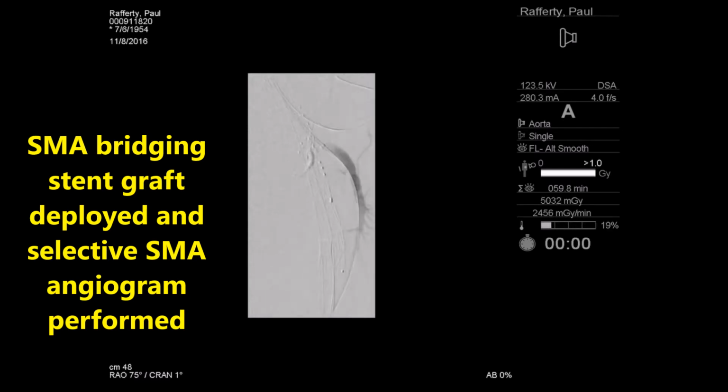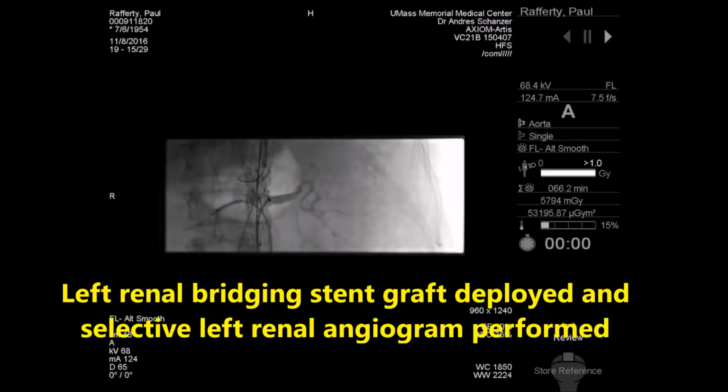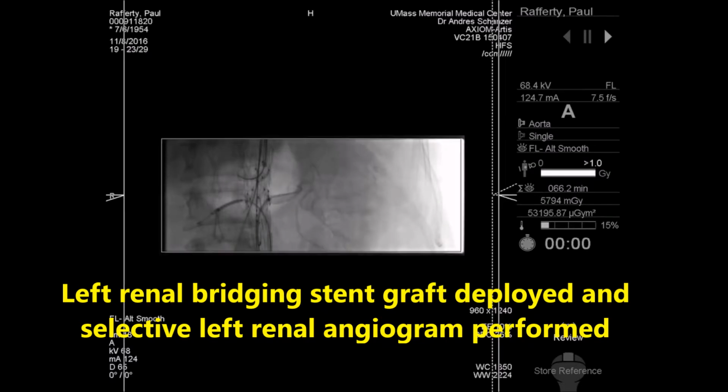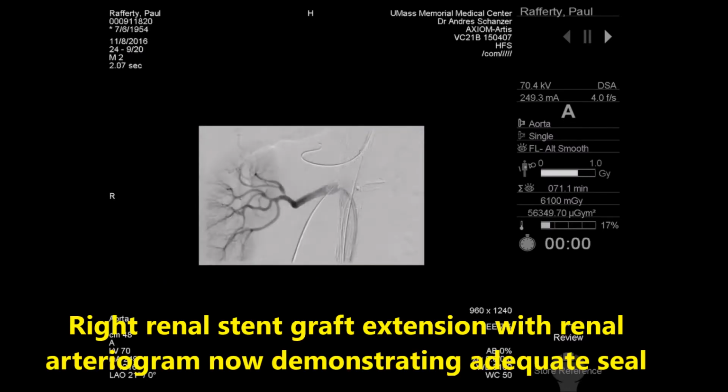An SMA bridging stent graft is deployed, and a selective SMA angiogram is performed. A celiac bridging stent graft is deployed, and a selective celiac angiogram is done. The left renal bridging stent graft is deployed, and a selective left renal angiogram is performed. The right renal stent graft is deployed, and the angiogram demonstrates an endoleak due to inadequate length of the bridging stent graft. After the right renal stent graft is extended, the renal angiogram demonstrates an adequate seal, with no remaining endoleak.